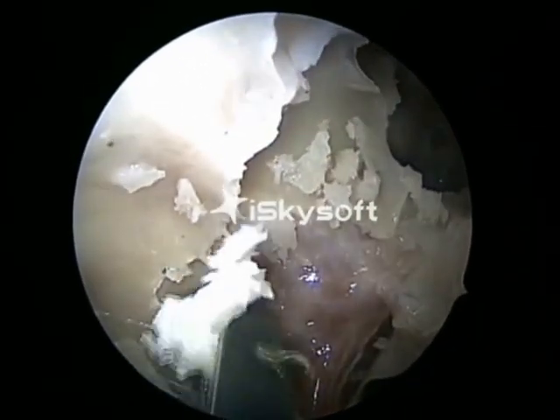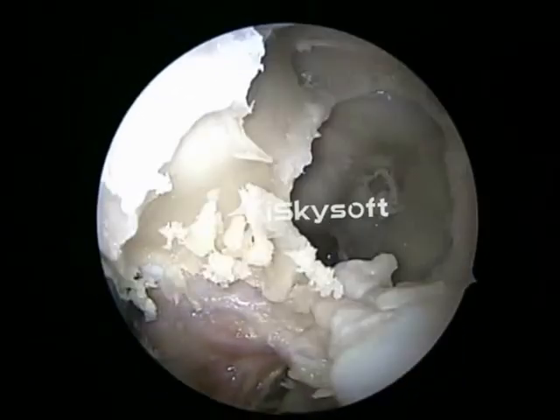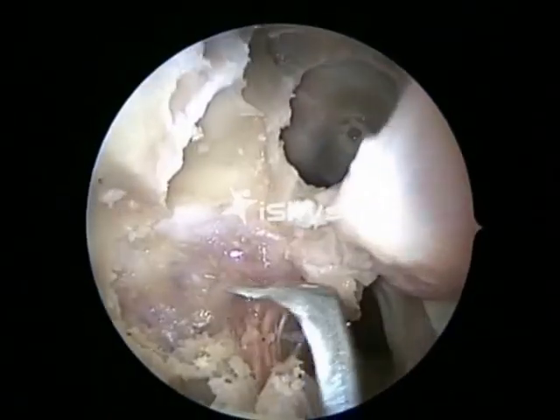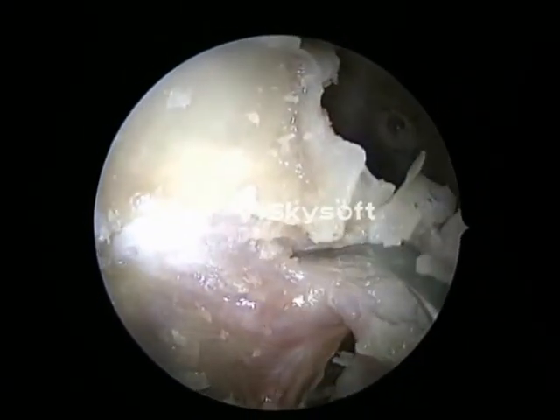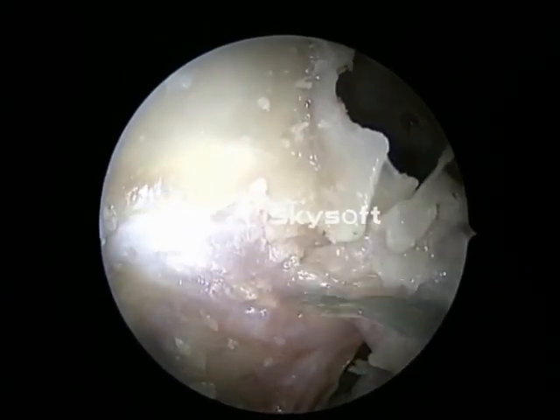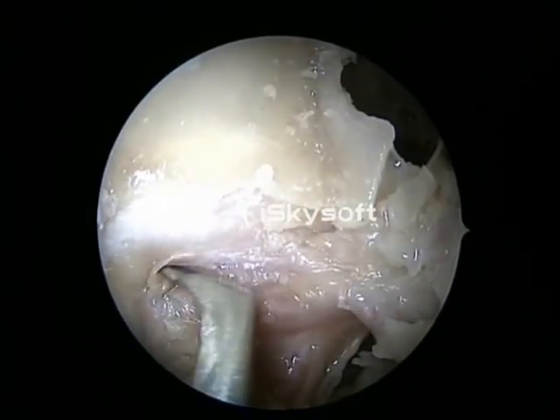We keep removing bone. The periosteum behind the bone is being exposed. And once we incise the periosteum, we will be directly over the internal maxillary artery.